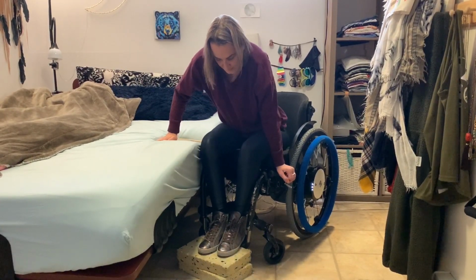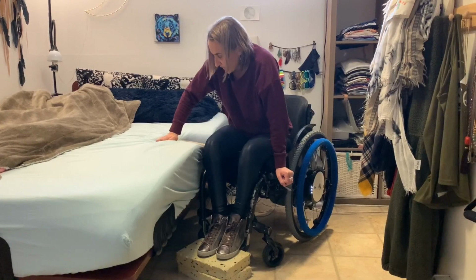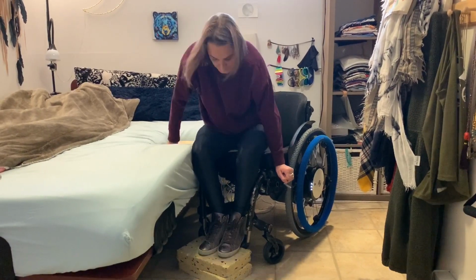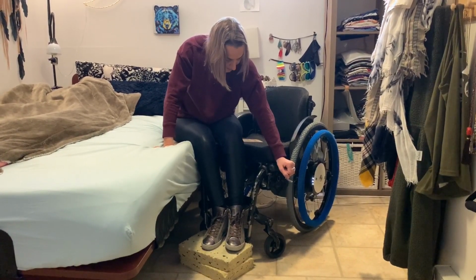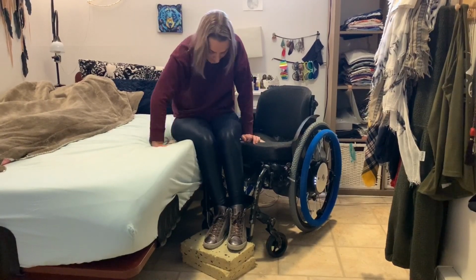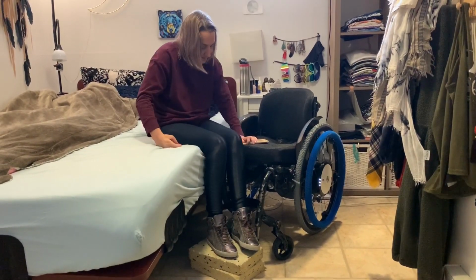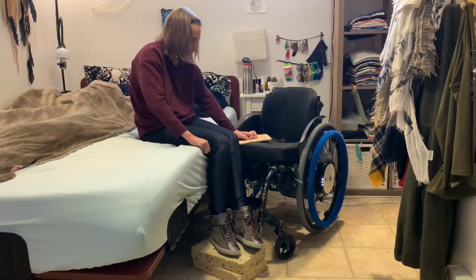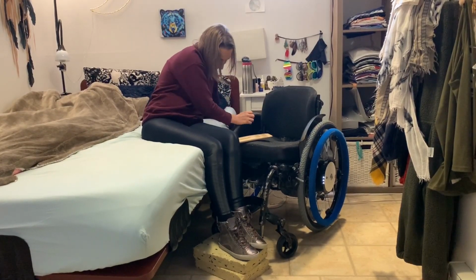So I'm shifting my weight forward. Once I'm here, I'm going to start pushing with my left hand to go to the right, and pulling with my right hand to slide onto the board. I also use my momentum to do so, and move my hand appropriately through the transfer to build whatever support I need. Then I'll push up this hand and twist around, moving my feet a little so they don't get stuck in the footplate of the wheelchair. Once I'm here, I'm going to bring my knee. Oh, whoopsies! Not enough grip there.